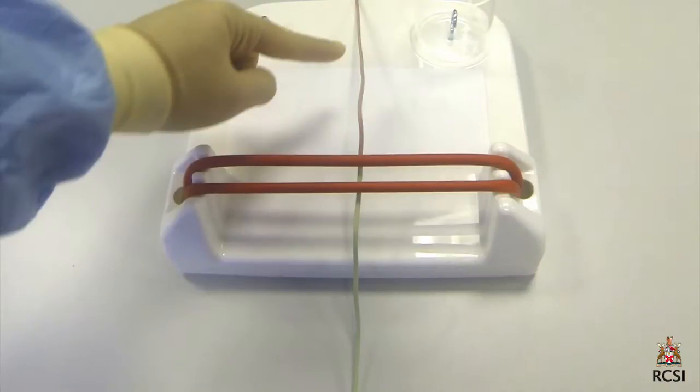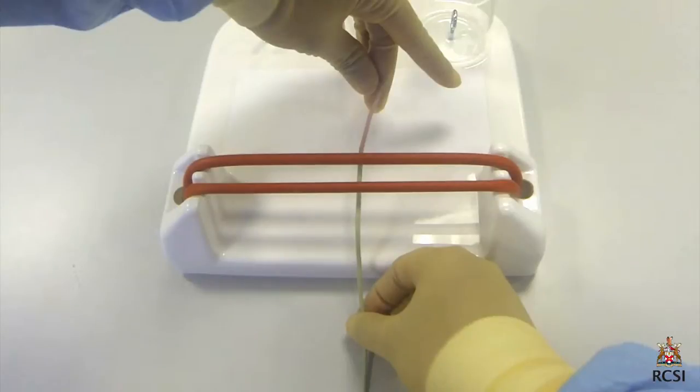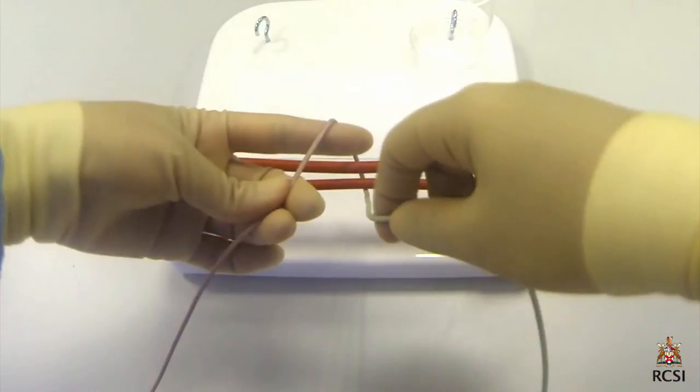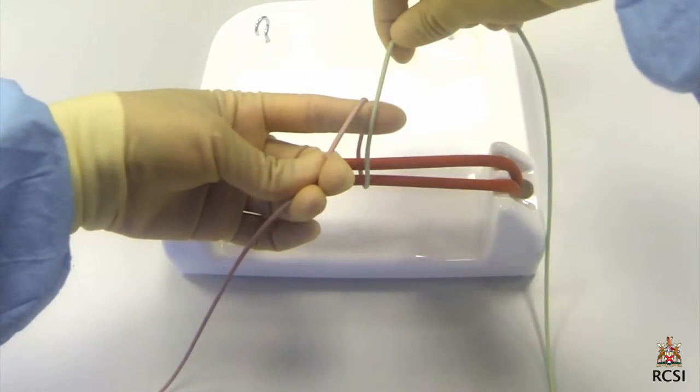When the short tying end of the suture is lying away from the surgeon, the first half of the reef knot is started with an index finger tie. The suture is picked up between the thumb and the middle and ring fingers while the left hand is supinated. The hand is then pronated so that the rope is presented upwards by the index finger. The right hand then lays the green long end of the rope over the tip of the left index finger, parallel to the pink rope.